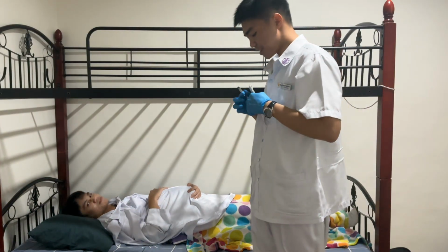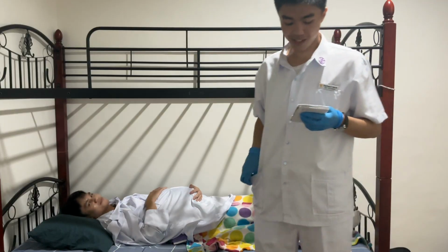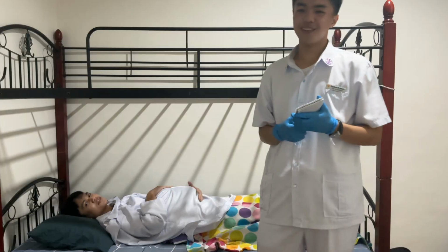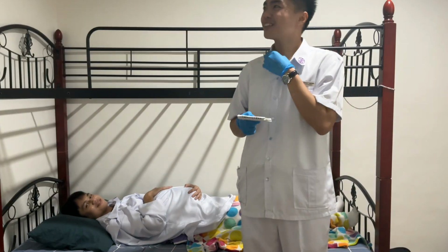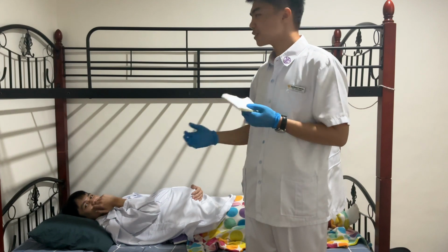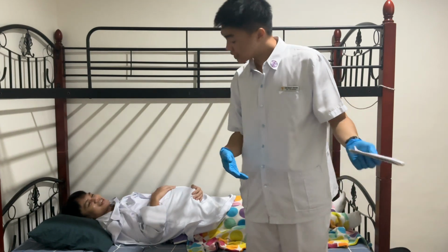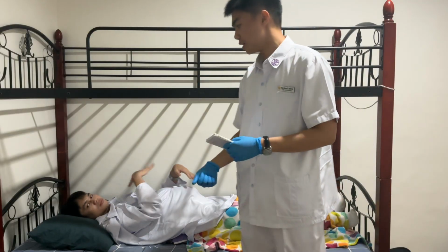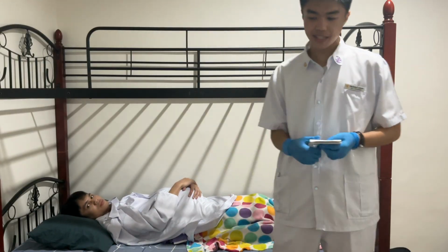So, mesmerizing siya, ma'am. You have already heard the baby and her fetal heart. She's a beatbox. So, that is actually normal, this galloping sound. It is because it is faster. Because when we did vital signs, 60 to 100 is our normal. For the baby it is 110 to 160 because she is very active inside.